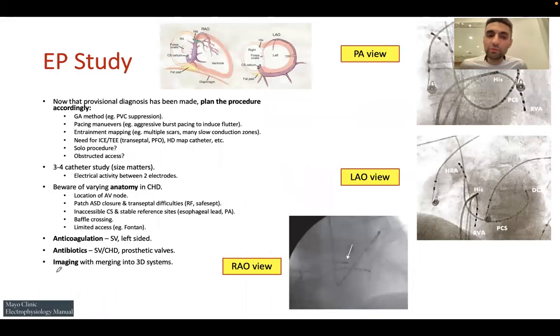So now we reviewed the patient's SVT. Now we go into the EP study. So at least for me as a pediatric electrophysiologist, usually we use general anesthesia, right? Imagine it's a PVC case, which we're not going to talk about today. I worry that general anesthesia might suppress the PVC. Imagine if it's an AV-NRT case, I worry that general anesthesia might suppress induction of AV-NRT, and hence the endpoint of the study would be difficult.